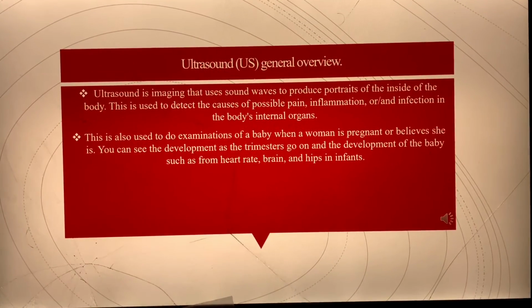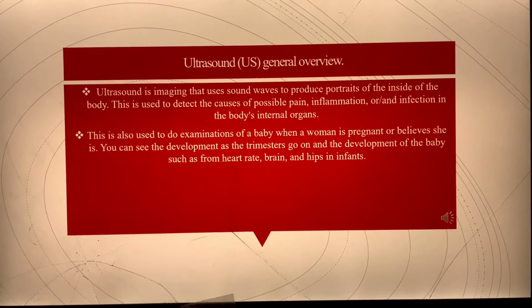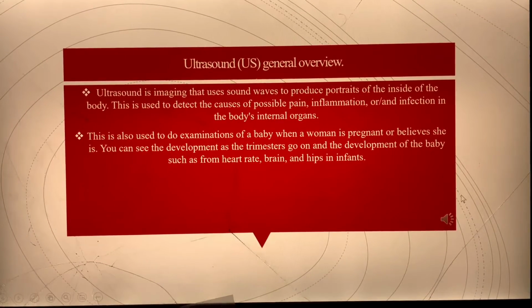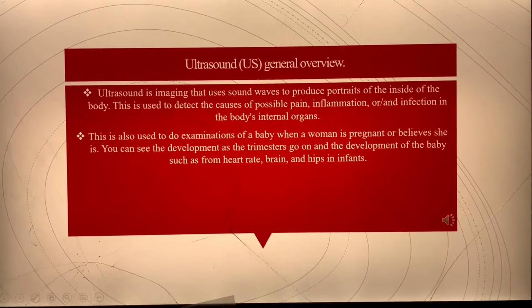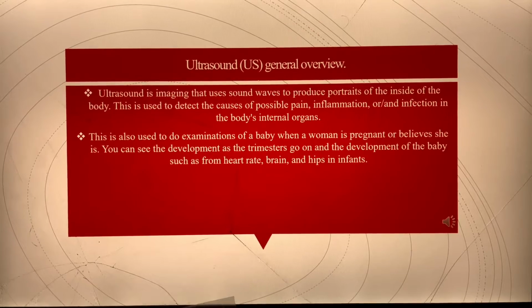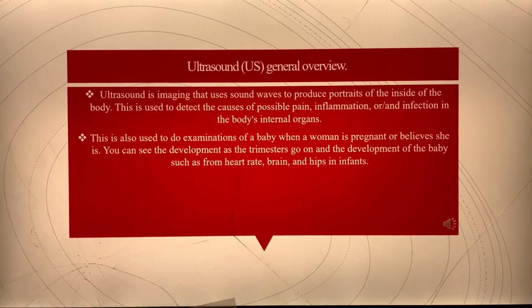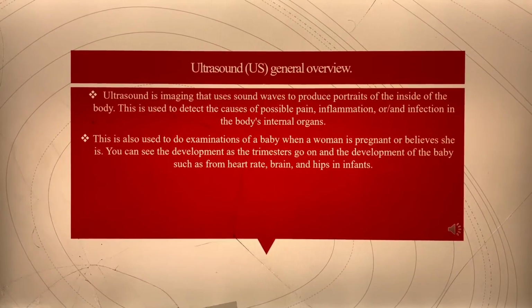This is used to detect the causes of possible pain, inflammation, and infections in the body, internal organs. This is often used for examinations of a baby when a woman is pregnant or believes she is. You can see the development as the trimesters go on and the development of the baby, such as the heart rate, brain, and hips in infants.